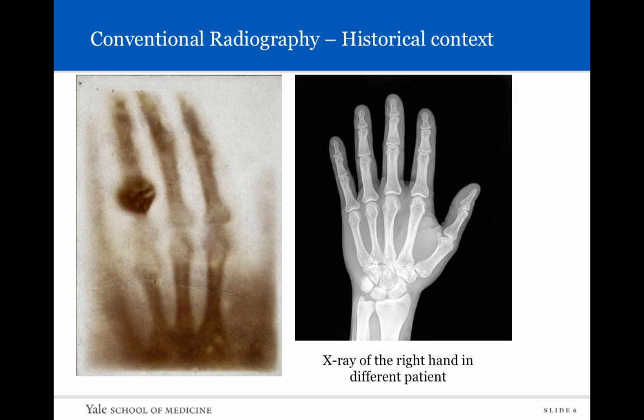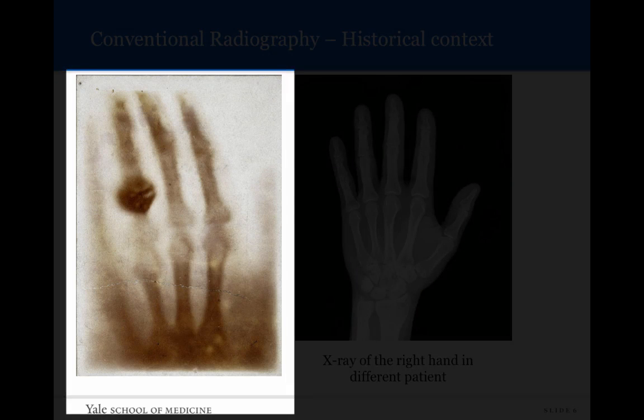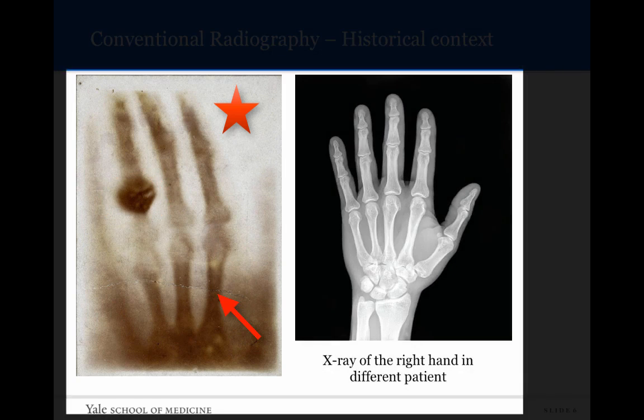This supposedly is one of the first ever X-rays that was produced, and it's said that this is the hand of Röntgen's wife. As you can see, some of the X-rays pass through her, and you can see the fluorescent screen in the back being very bright or white, and some of the X-rays don't pass through her. Not through her bones over here, which are dark, and not through her ring as well, which is very, very dark. When you take these X-rays and project them onto photographic film, the areas that are bright on the fluorescent screen will blacken the photographic film, while the areas that are dark on the fluorescent screen will be white on photographic film. Essentially that's what an X-ray as we know it looks like. So this is what it would look like if you just invert those colors.